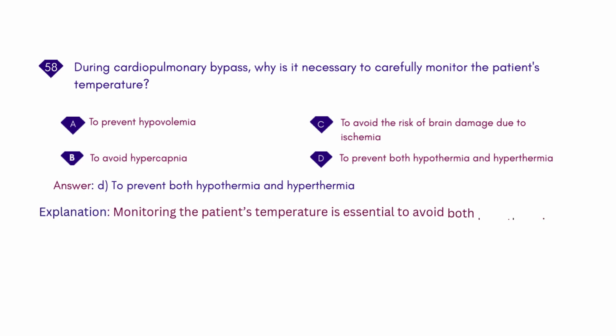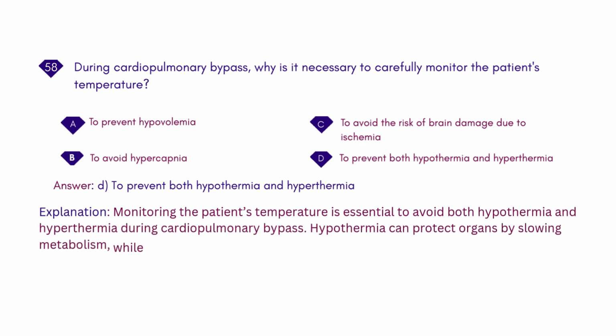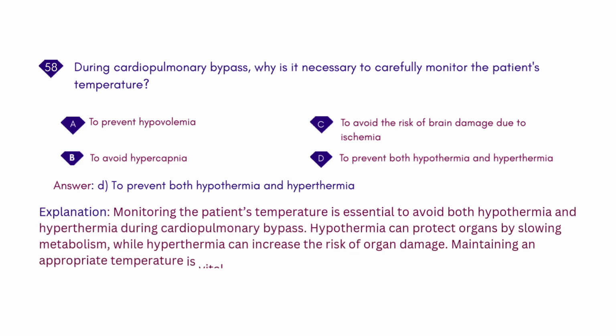Explanation: monitoring the patient's temperature is essential to avoid both hypothermia and hyperthermia during cardiopulmonary bypass. Hypothermia can protect organs by slowing metabolism, while hyperthermia can increase the risk of organ damage. Maintaining an appropriate temperature is vital for patient safety.